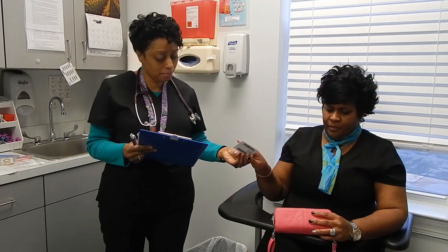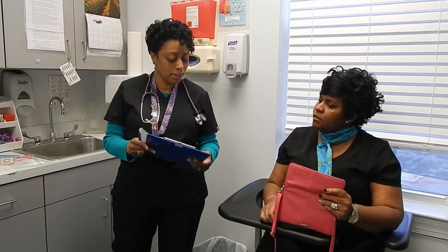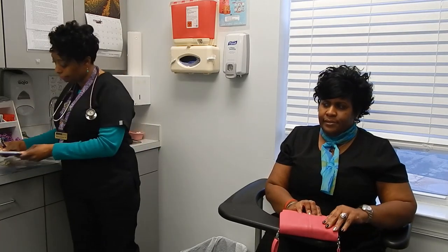Thank you. Before I complete this I'm going to need to use your social or your employee ID number. Is this employee ID number correct? Yes. Thank you. And it says here the reason for the test is for pre-employment. Is that correct?